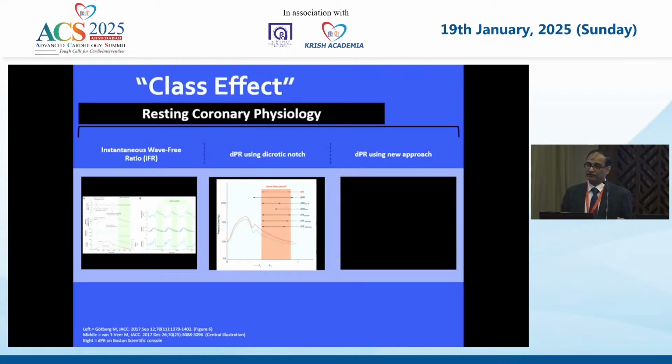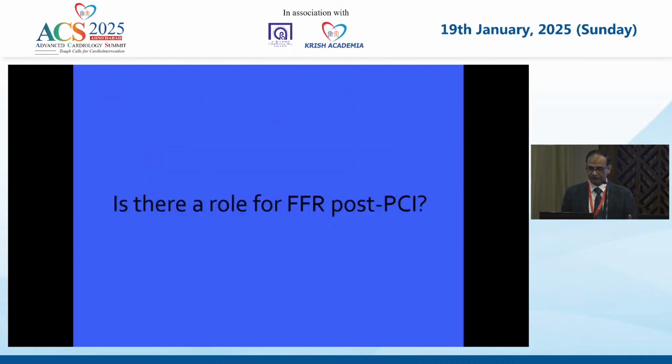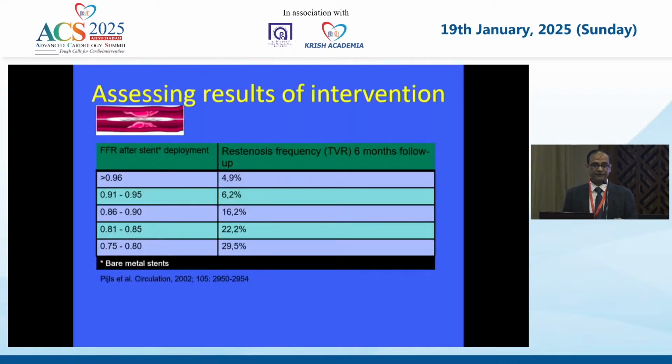Now, resting coronary physiology is thus now known to be a class effect. It's not an individual thing, and it's appeared in guidelines across, and a hybrid FFR. Now, post-PCI FFR is something that is very, very exciting. I've picked up this particular slide because this shows that we've known this for a long time. This is from the bare metal era.